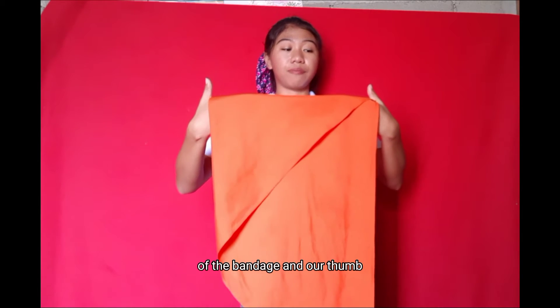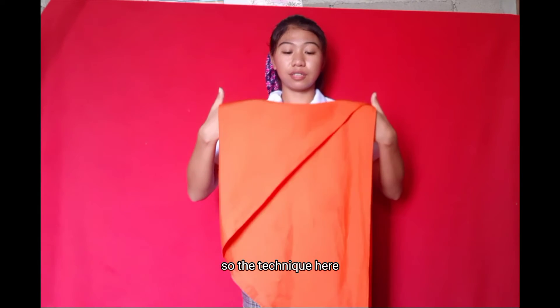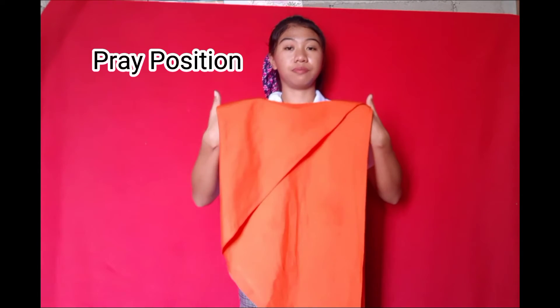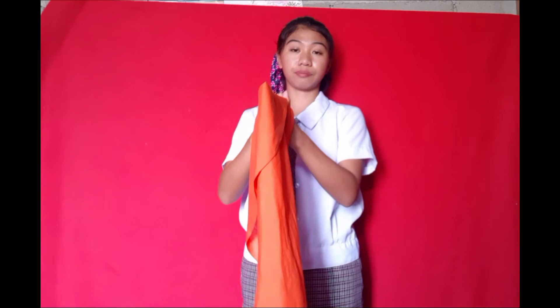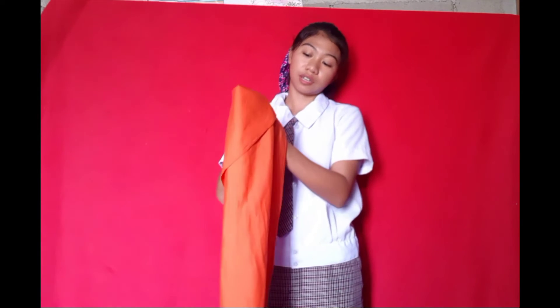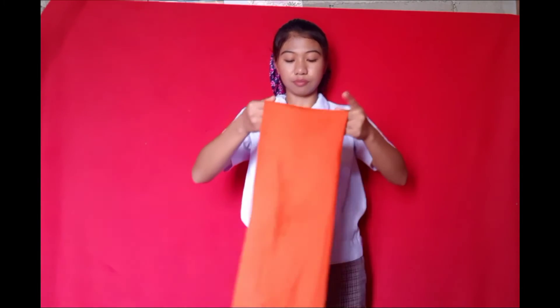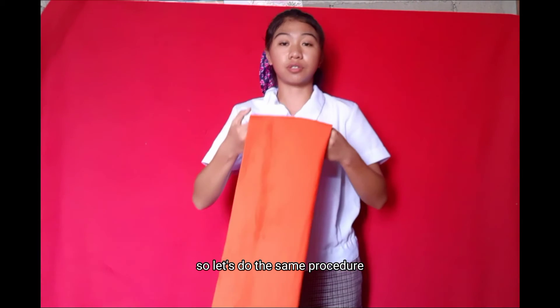Our thumb is standing like this. The technique to fold it properly is to do the pray position, just like this — just like that. Then put our right hand inside, then pull it out. And here now is our semi-cravat face.